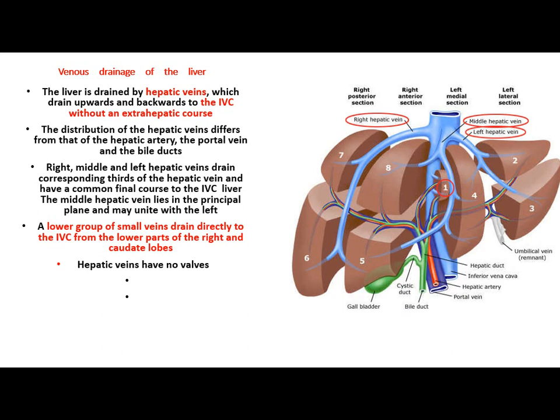So what do you think will happen to the artery? Compensation. It will increase in size. It's not smaller, it is bigger. So when you have portal vein abnormality, usually you see the hepatic artery more obvious. You see it with Doppler clearer and bigger and better. Because it will be the star. Hepatic artery first.